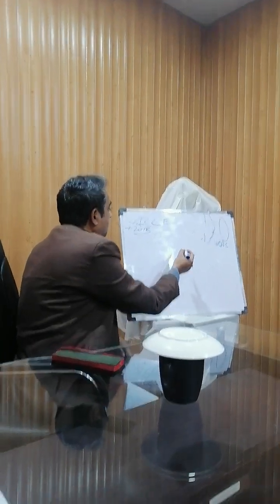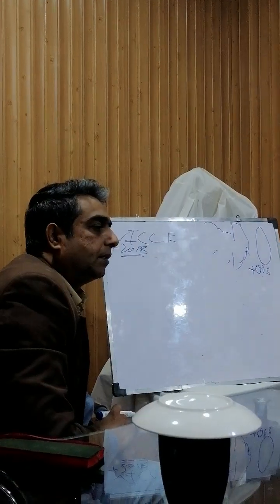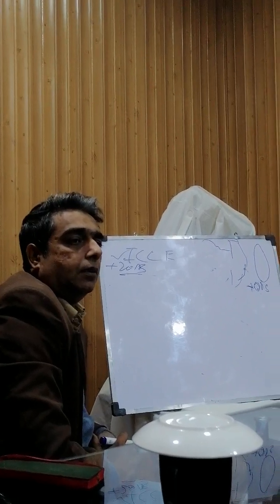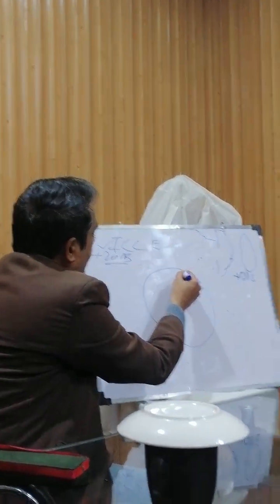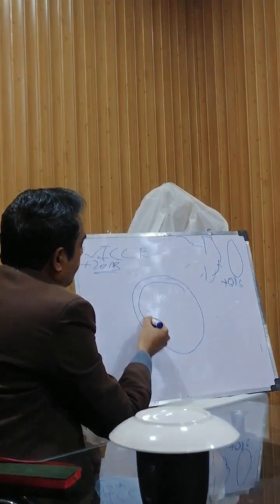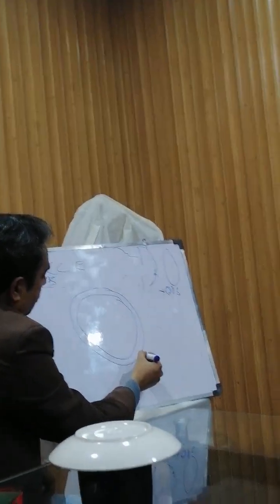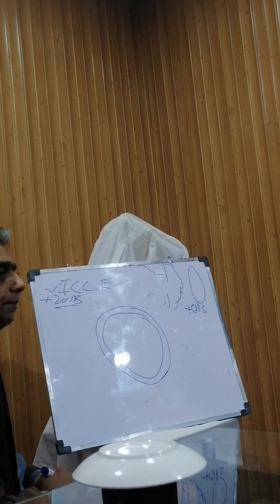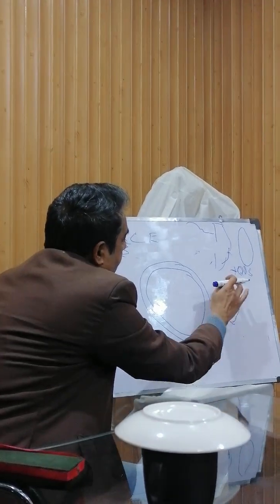Now we will discuss how we perform the phacoemulsification. I told you about the previous surgeries, because now it will be easier for you to understand phacoemulsification. So similarly, this is the limbus. This is the dilated pupil, and for example, here in the supratemporal part we give a 2.8 to 3 millimeter incision only, and this is the sagittal section, and we give a small incision.